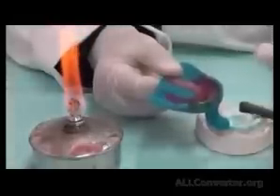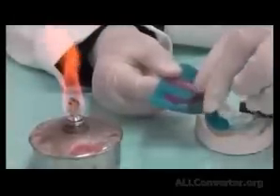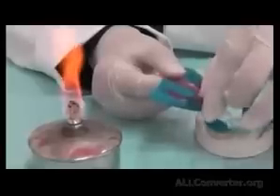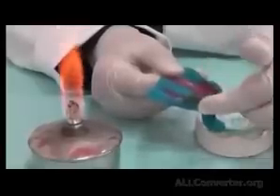I wet my fingers using water, and then I mold the border with the green stick. Anything that went to the buccal side, I remove it. Anything that went into the lingual side, I take it out. And I join the material together and make of it a roll.